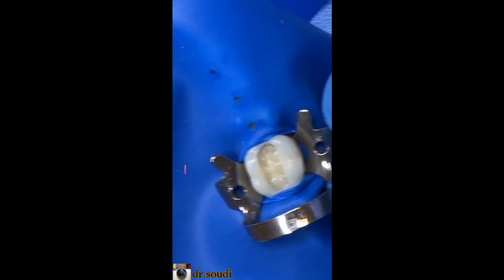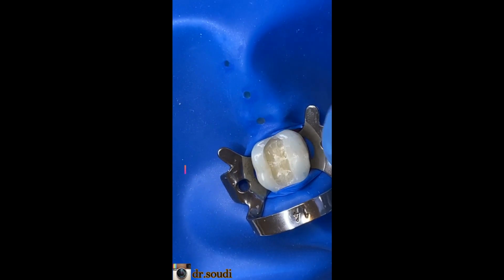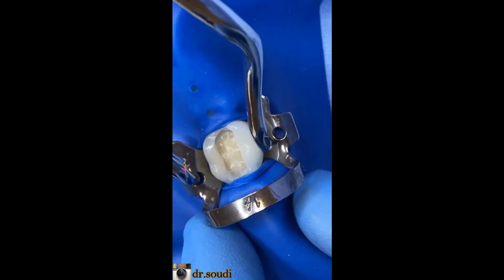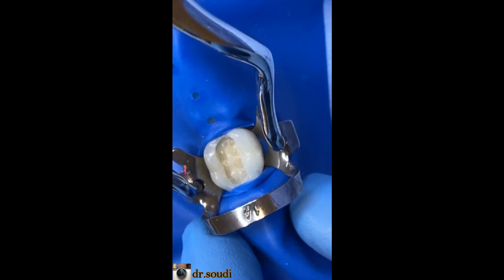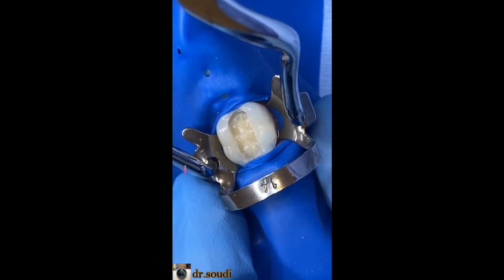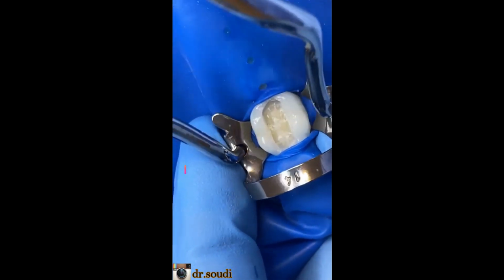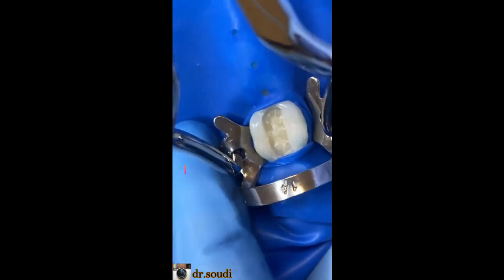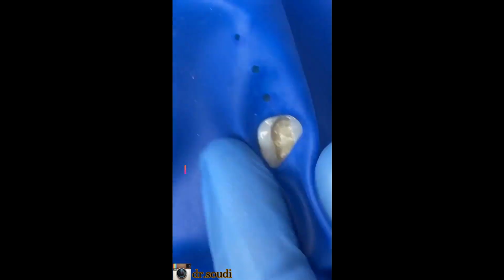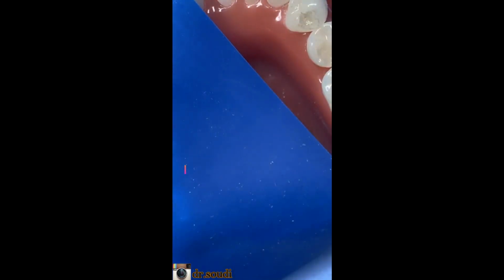I need to slip the sheet here under the clamp. So I will open the clamp from here only to make the sheet slip under the clamp. I will place my forceps again, press from here, from the lingual part, press against the tooth and open the clamp from only one end like this. You are pressing and opening it. The sheet, you can lift it up, the sheet will escape to the tooth. Okay, you will have your sheet between the tooth and the clamp. This is clamp rocking. Clamp rocking means you need to slip the sheet under the clamp.